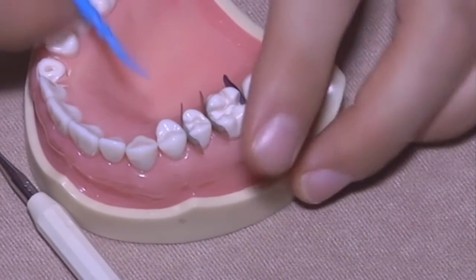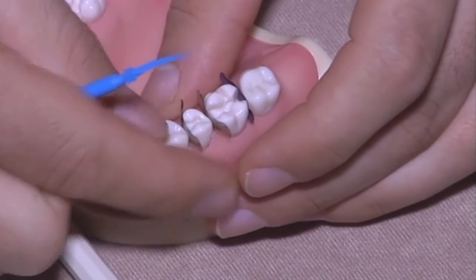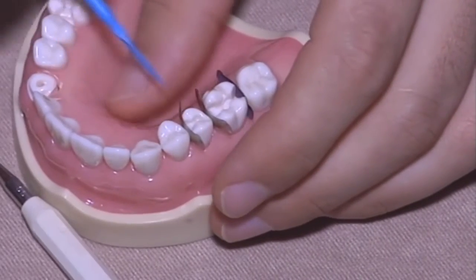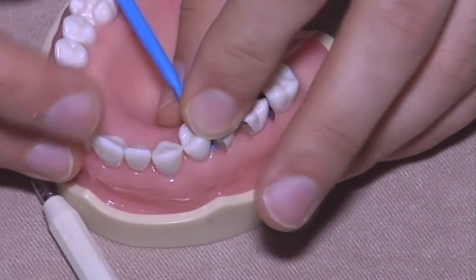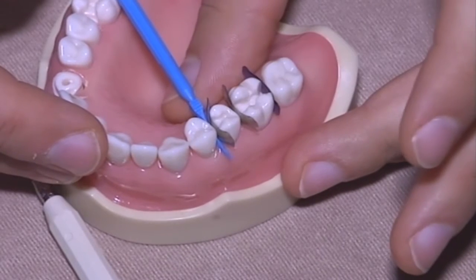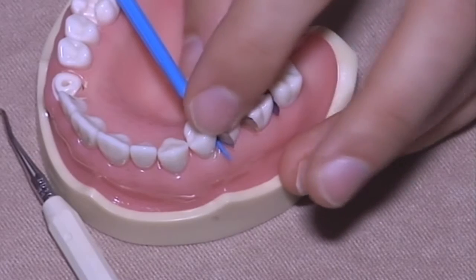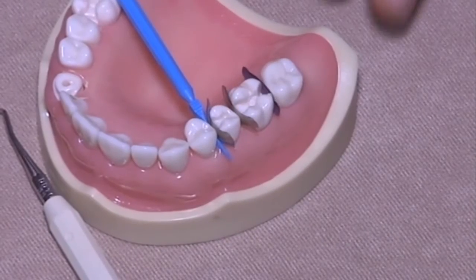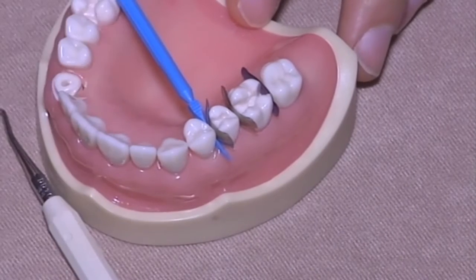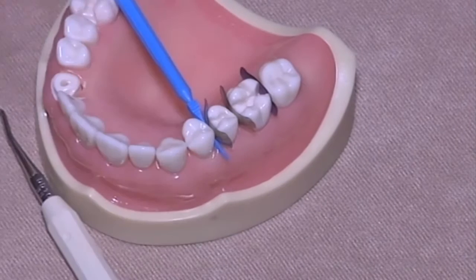The shape depends on the dimension of the interproximal space you have. So here I think that a blue one would be okay, and every time you place the wedge, you have to keep the matrix blocked with your finger or with your forceps or with an instrument. Otherwise, when you push, the wedge will push your matrix over.